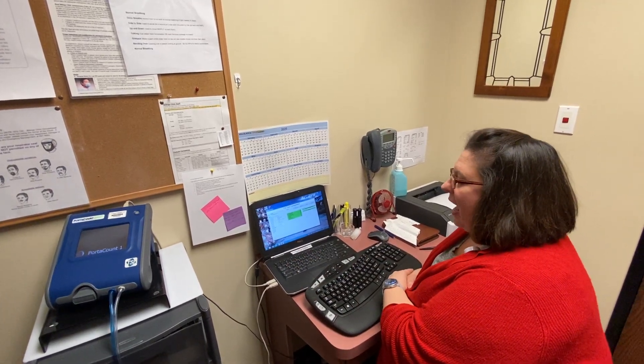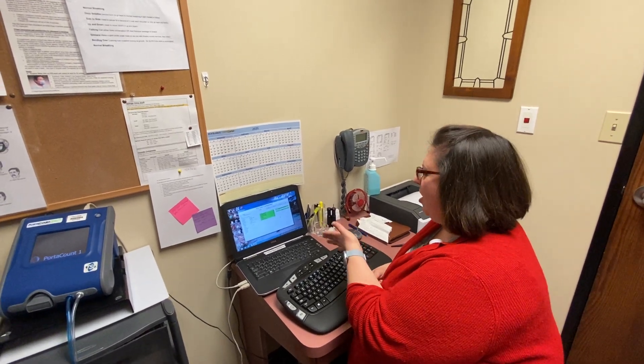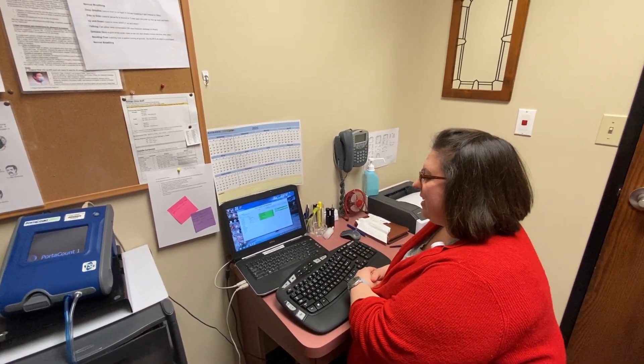It is generally about the highest it will quantify is at 200. And as we were going along, there's no fluctuations. It looks like it's an excellent seal.